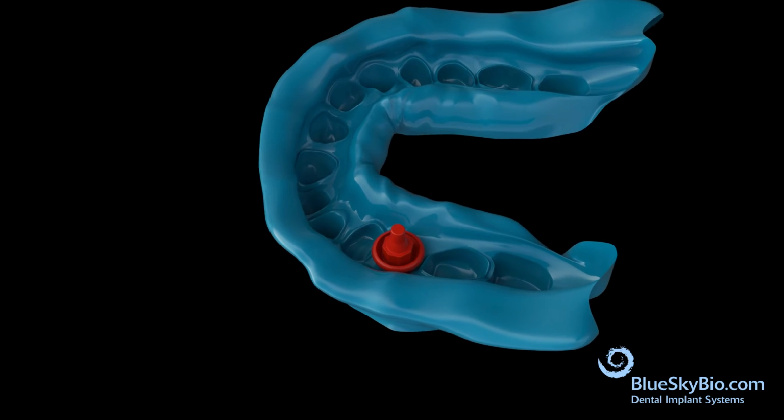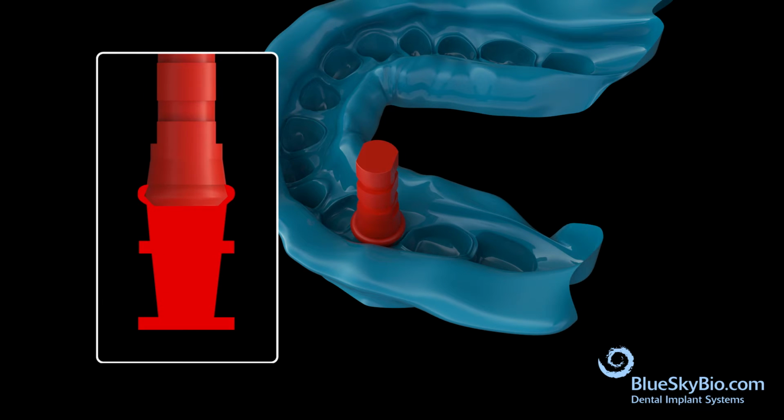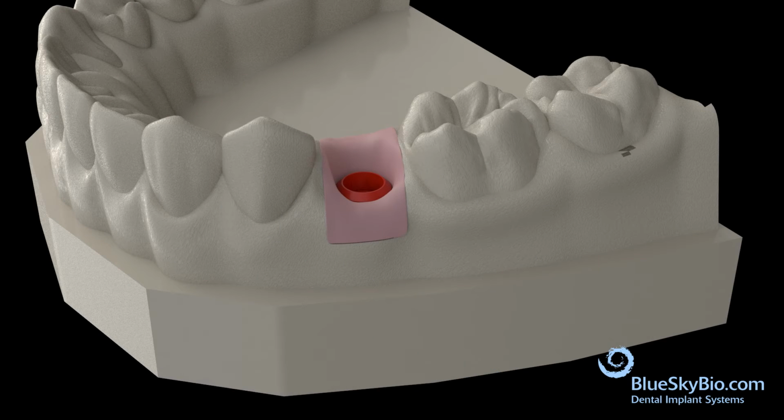Insert analog into the impression cap. Apply soft tissue replica material. Pour dental stone into the impression. Remove the stone model from the impression.